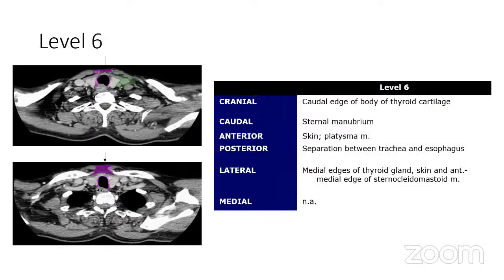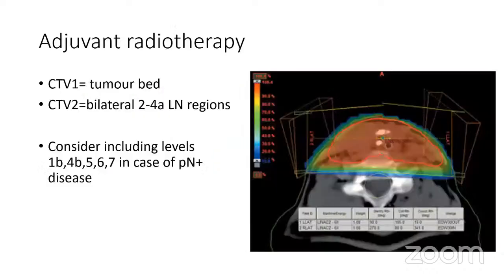The other question that someone asked me quite recently was about covering the stoma and how important that is when you've got radical radiotherapy going, but you've had a tracheostomy done previously. So if it was an emergency tracheostomy, you would definitely want to cover it. And if there was suspicion of subglottic spread, you would again want to cover it. And possibly if it was transglottic as well. So I think that's important to know, even if it doesn't appear involved, that you would need to cover it with a lower dose.